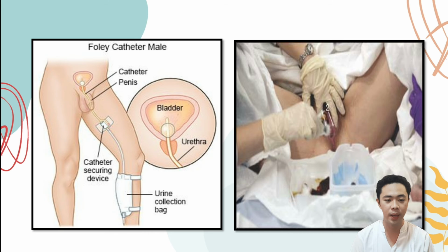For females, supine with knees flexed, feet about 2 feet apart, and hips slightly externally rotated if possible. For males, supine, thighs slightly abducted or apart. Next, establish adequate lighting. Stand on the client's right if you are right-handed, on the client's left if you are left-handed. If you are using a collection bag and it is not contained within the catheterization kit, open the drainage package and place it at the end of the tubing within reach.